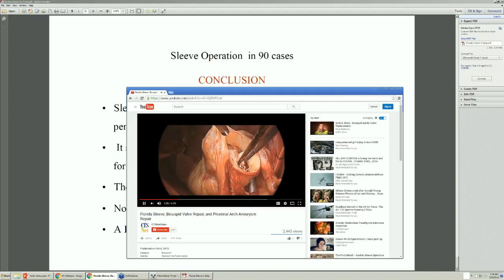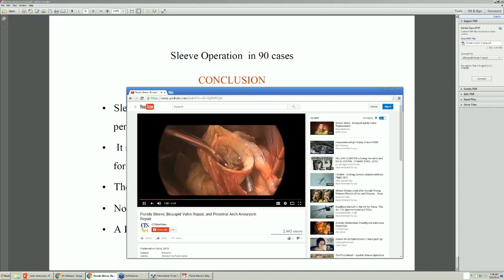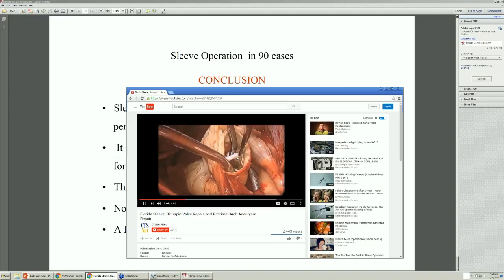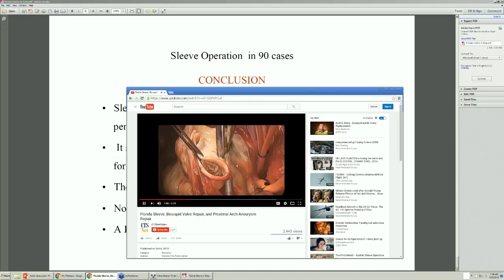We're just starting this with a Metzenbaum scissors, taking care to siphon off any dropped calcific debris. And once we've cut off as much as we can, taking care not to injure the leaflet or create a perforation, we're going to take a pituitary rongeur and clean up any rough areas to smoothen it a bit. And now the leaflet is much more pliable.